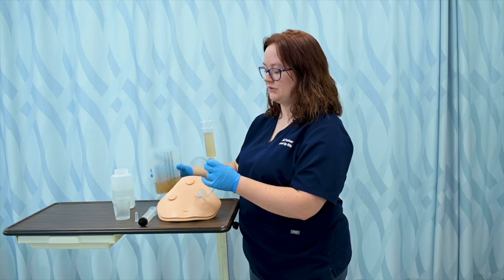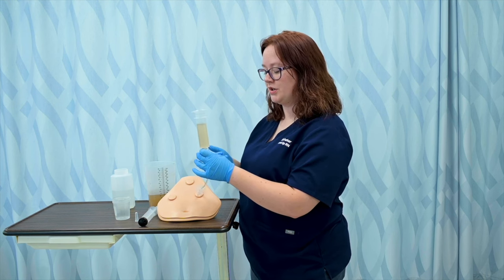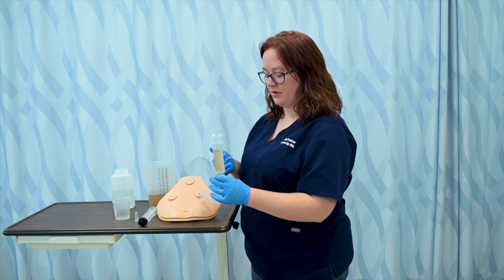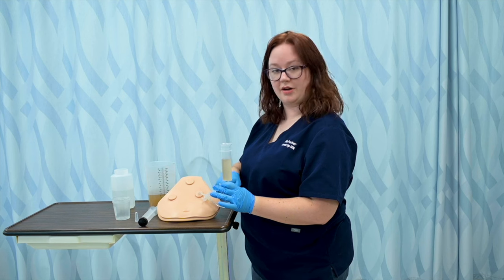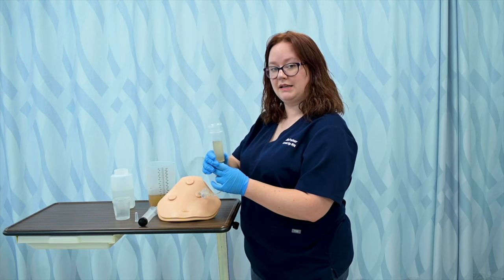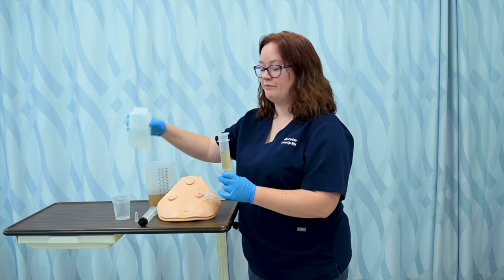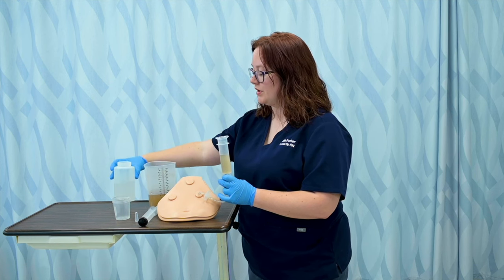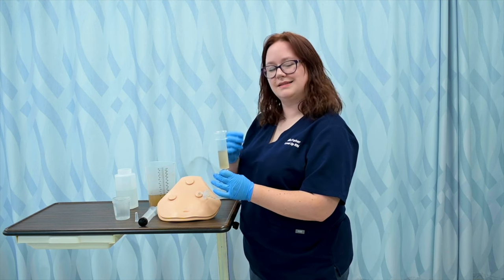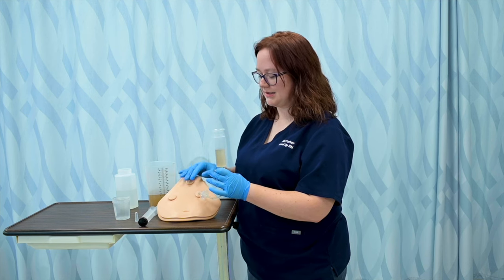Once I flush with water, I'll pour the formula slowly into my piston syringe — just like I did the water — and allow gravity to introduce it as well. I can change the rate of administration by lifting the syringe higher, which makes it go faster, or pulling it down lower so it has to work up a little incline. Once that has completed, I'll flush again with 30 milliliters of water by pouring it into the open end of the syringe. This helps clear the tube of any tube feeding, since the consistency is a bit thicker and we don't want to lose patency. And that's how I give a gravity feed.